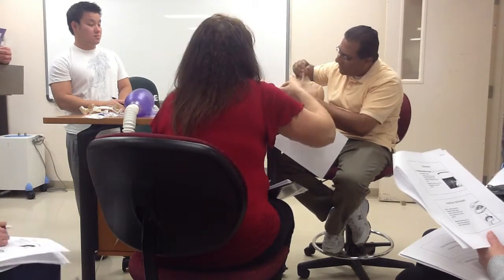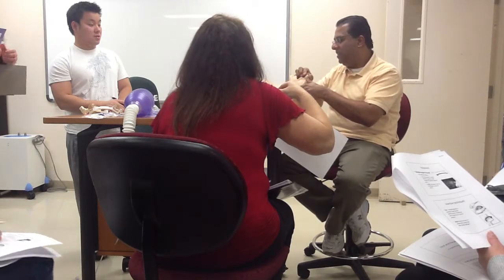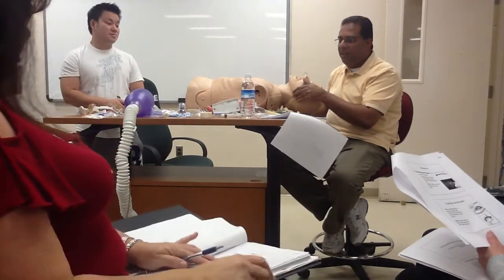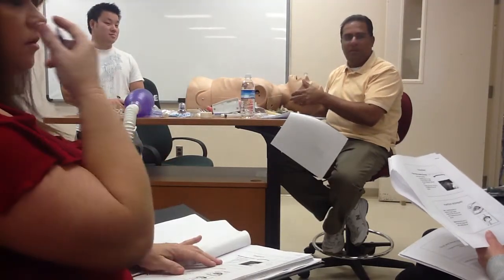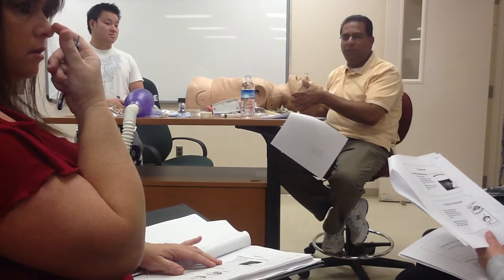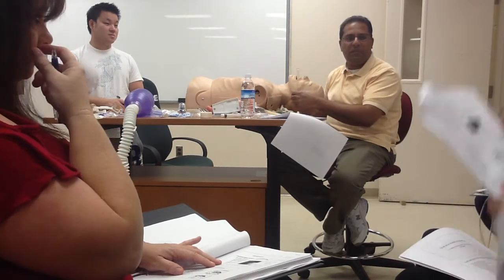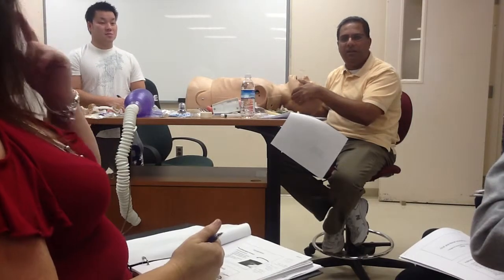Wait. Don't let the tip keep coming out of center. It's kind of like a six. Oh, there you go. It's probably a better one, yeah. Good. Yeah, that's the center, perfect. No, right here, it looks huge. It looks too big to me. Measure it from the tip of the earlobe to the middle of the nostril. It's too big.